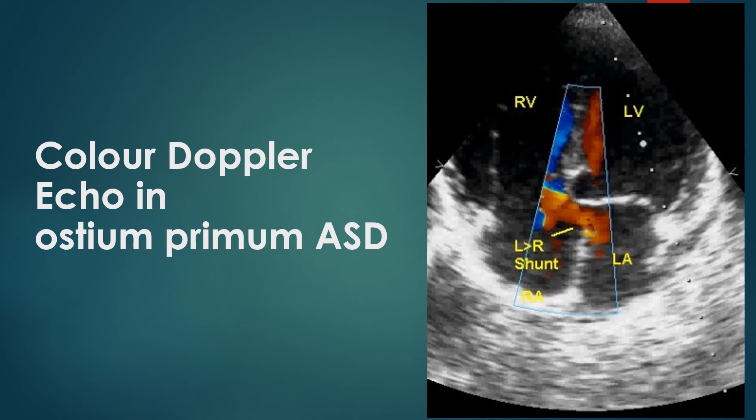Color Doppler echocardiogram showing left-to-right shunt in ostium primum ASD. Though the actual direction of shunt is perpendicular to the beam direction, most of the blood moves from left atrium across the ASD towards the tricuspid valve in a direction parallel to the beam and towards the transducer — that is why the flow is encoded red.